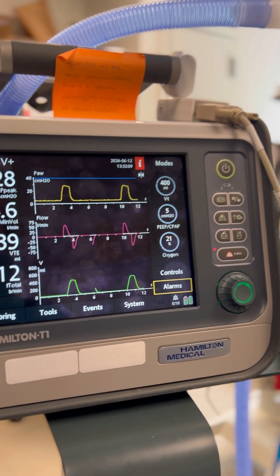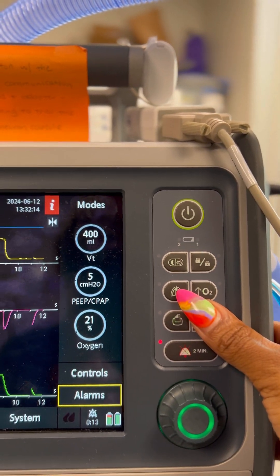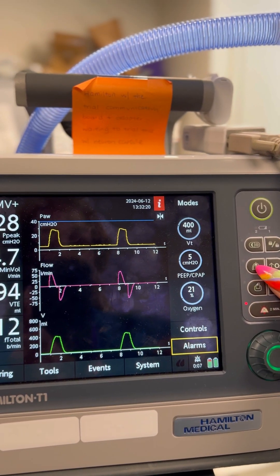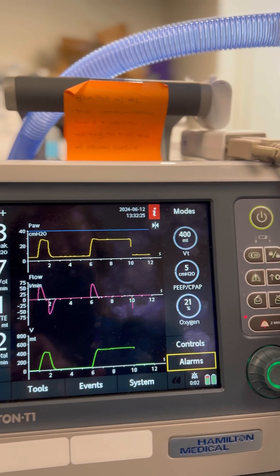What we're going to do is hold down this button here — this is going to be our manual inspiration button. We're going to press it and hold, as we would for any other inspiratory hold maneuver. We'll hold it for a couple of seconds and then release.